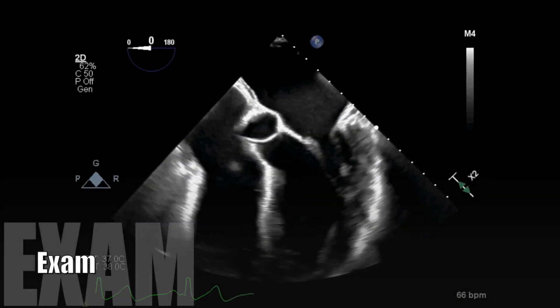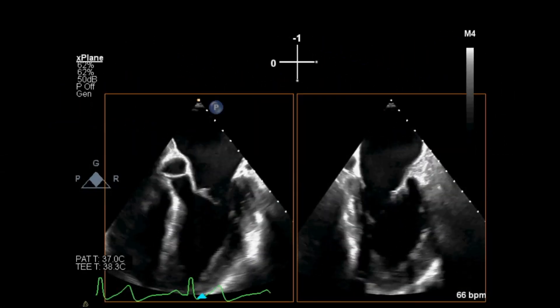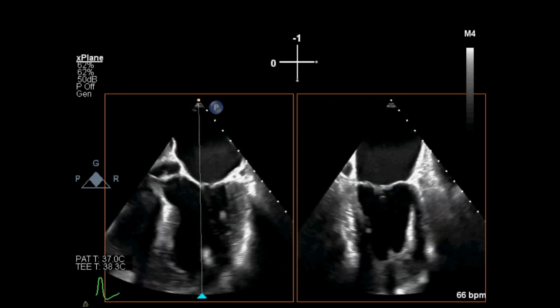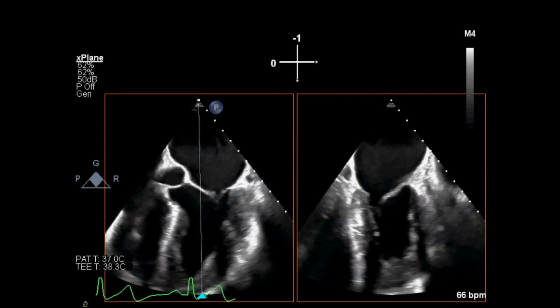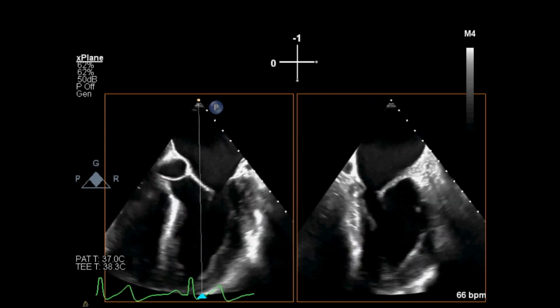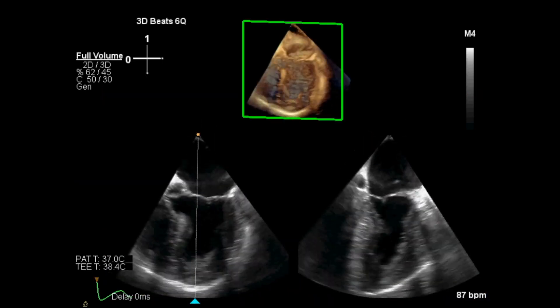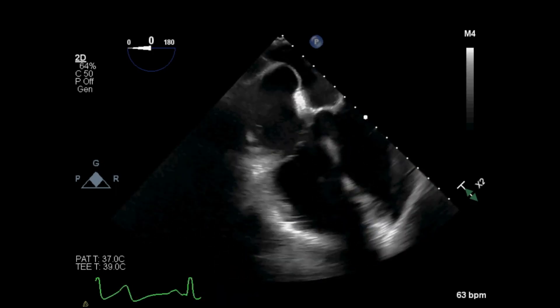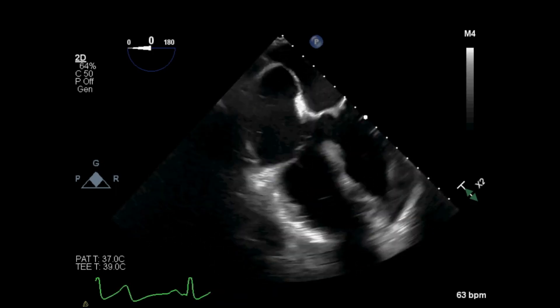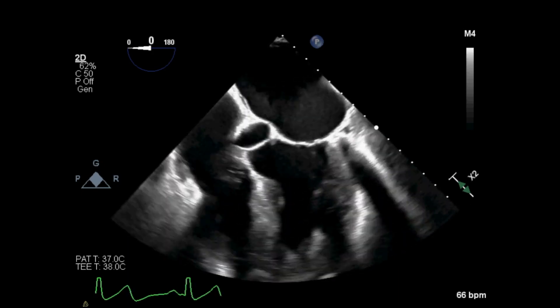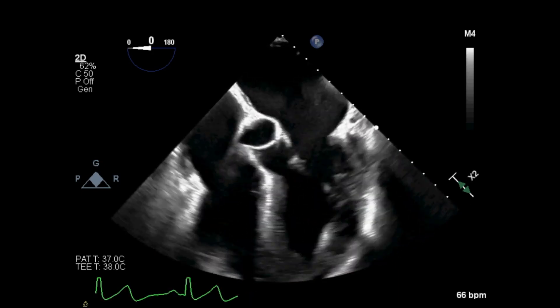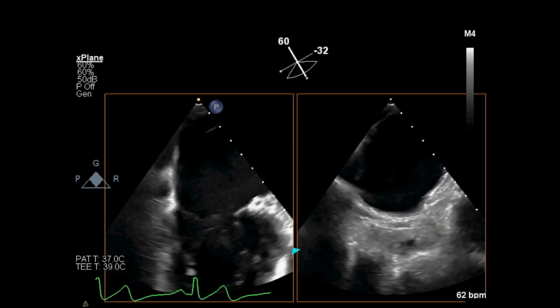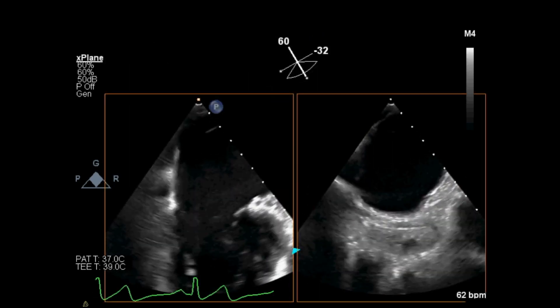I start with the five-chamber view and biplane through the left atrium, mitral valve, and left ventricle to simultaneously obtain a two-chamber view. If I am using a Phillips machine, I also capture a full-volume 3D clip. I then get an impression of the right atrium, tricuspid valve, and right ventricle. I shift my focus back to the left side to assess its structures at different omniplane angles, noting that between 60 and 90 degrees, the left atrial appendage and left upper pulmonary vein can come into view.